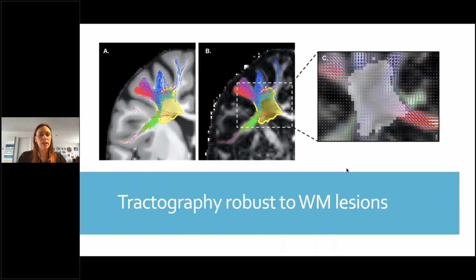So, for the white matter mask, we did manual and automatic segmentations, and they were fused to produce the lesion mask that you can see here in yellow. It was covering all the white matter lesions that were visible on the T2 FLAIR and T1 weighted MRI images.